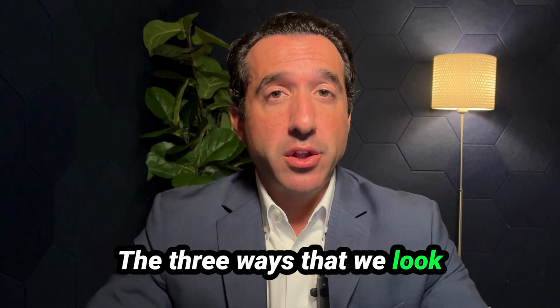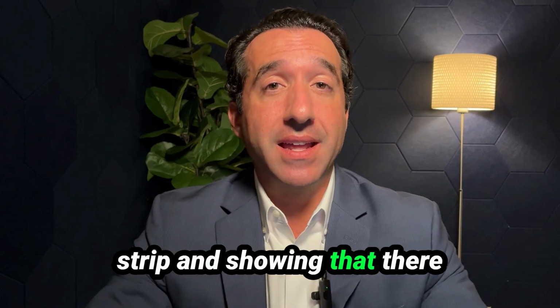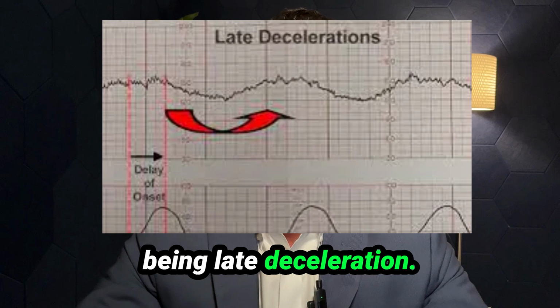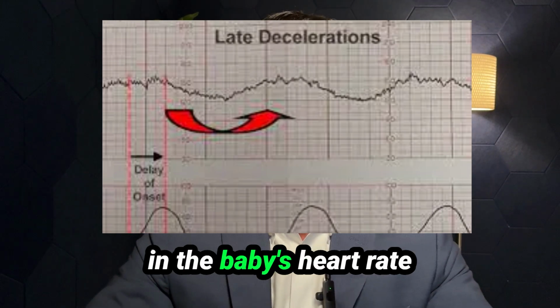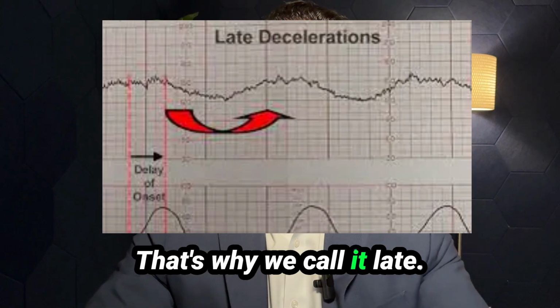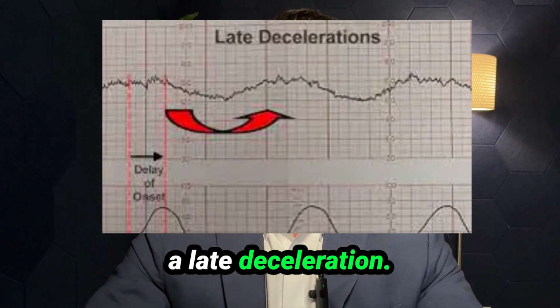The three ways that we look at a fetal heart monitoring strip and show that there is fetal distress is, the first being late decelerations. A deceleration is a drop in the baby's heart rate after a contraction. That's why we call it late. It's not early, it's not at the same time, but a late deceleration.